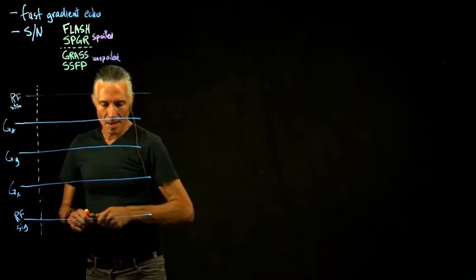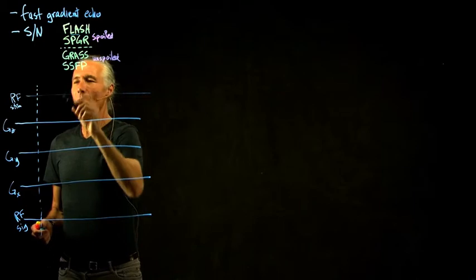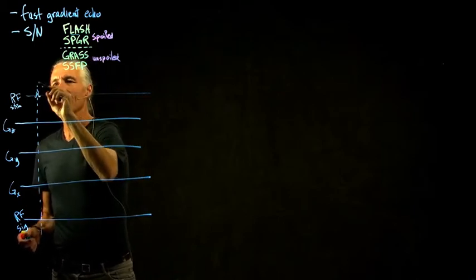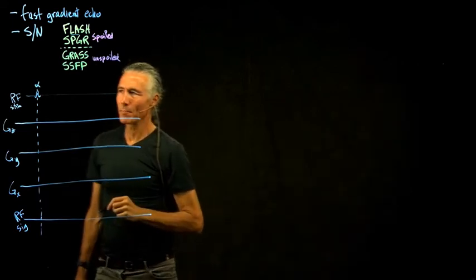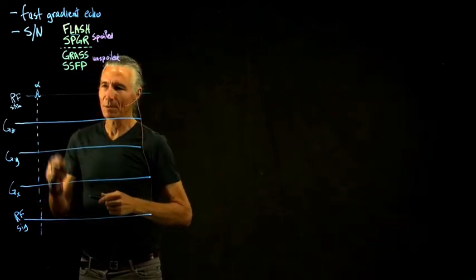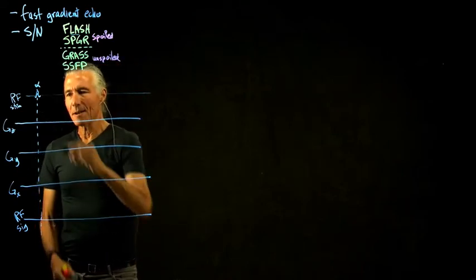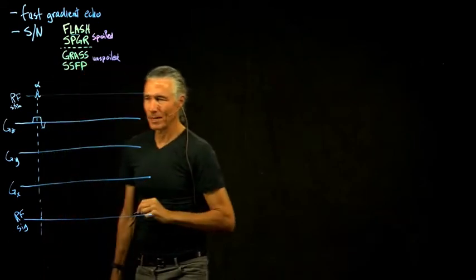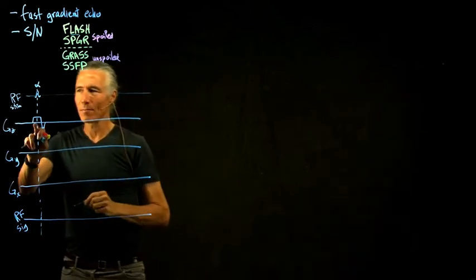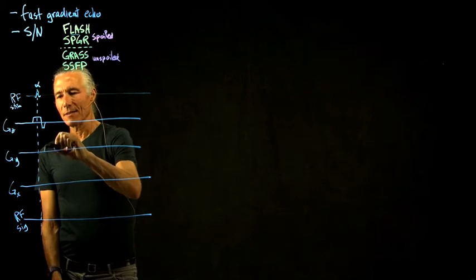Since it's a fast low angle shot, we'll have an alpha pulse here, so not a big pulse like a 90 pulse, and we'll explain why we want to do that. And then we have to do a slice select. So here's our slice select. We didn't explain how we do that, or why it looks that way, but we'll talk about that later.